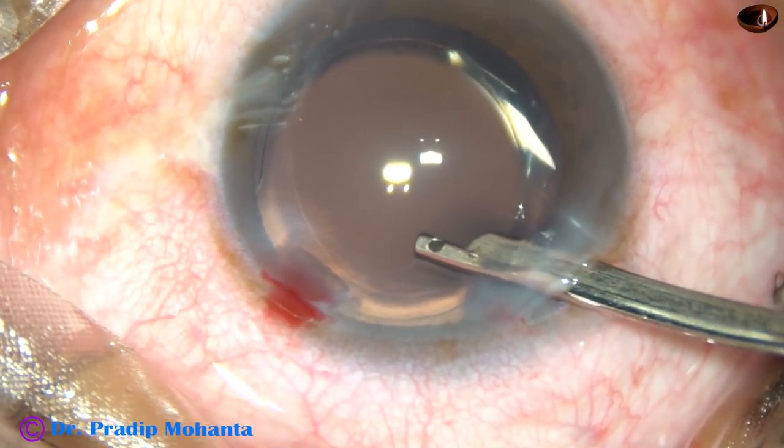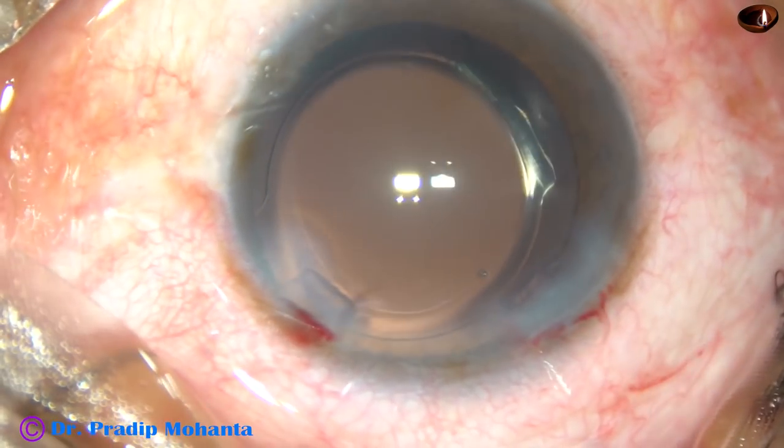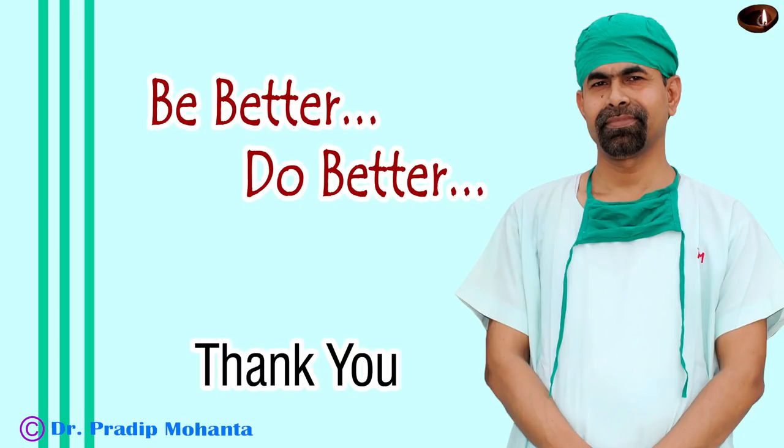And now, a corneal seal at the main incision — give a forward push and conclude the case. Thank you very much for your attention. Hope this video will help you in learning the lens tilt technique, which is a very safe technique for soft cataracts.